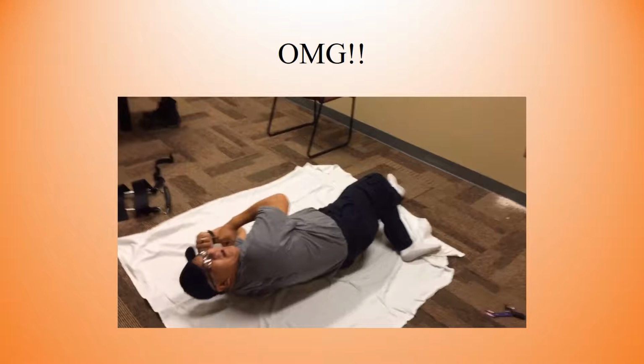While that looked pretty painful, he might have a femur fracture. So let's see what we could do about that.